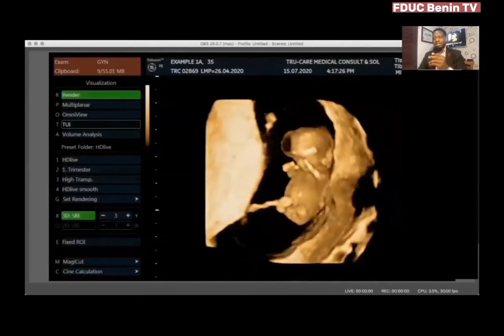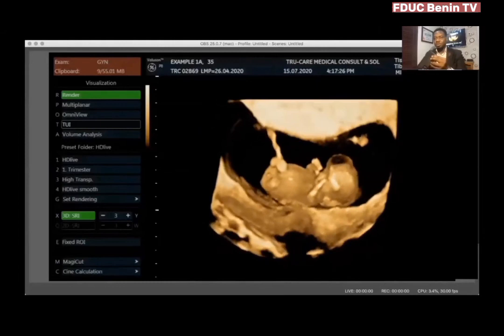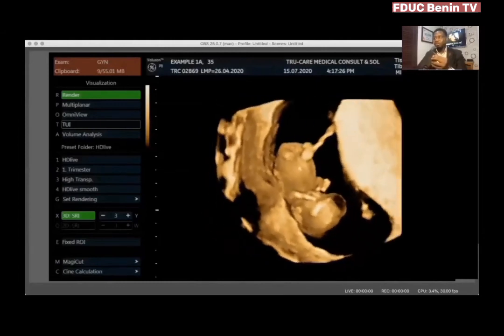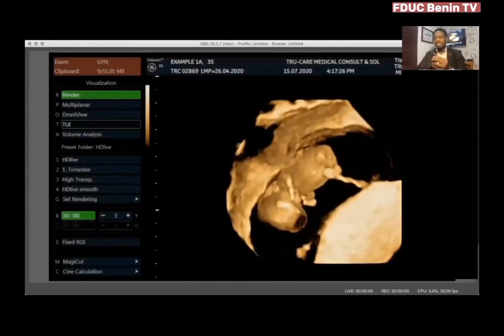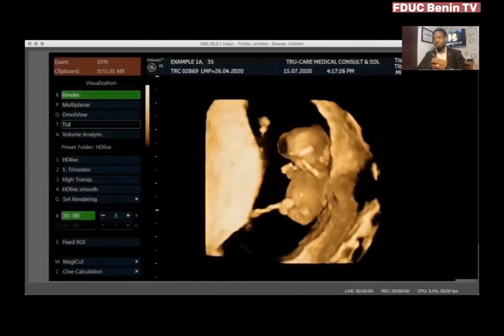And then lastly, if we begin to hold this phone like this, and instead of rotating like this or rotating like this, I begin to turn the phone like this, like a cartwheel, it means that I'm turning it along the z-axis, just the way I'm doing for this image over here. So these are the basic axes along which we rotate images.